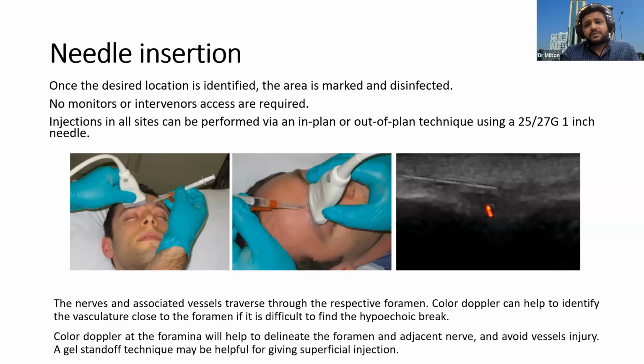And a very important part: during the intervention, you should not touch the blood vessels, because these blood vessels give an important supply. Try not to pierce the artery.